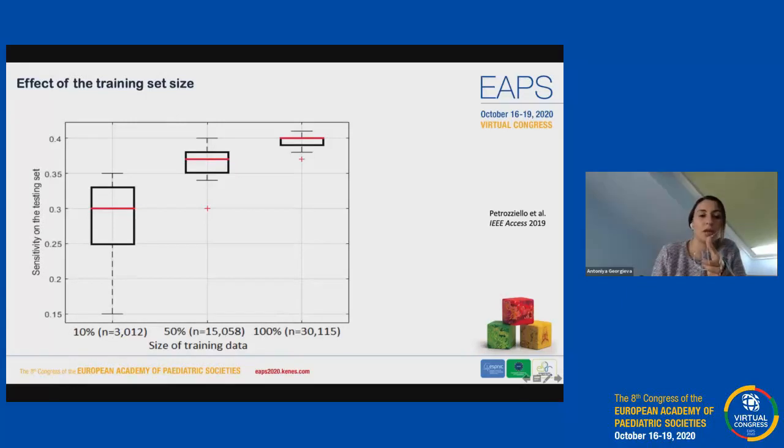And what we're looking at here is the different training data sets, and we're looking at the sensitivity. So this is this yellow bar we just looked at. And the reason why we have a range of values here is because we train multiple models, right? And that's what everyone should be doing. There are variances in the initialization of the weights of the model, and there are other elements. You can think of it as bootstrapping, what people do in statistics as well. This is how you assess whether your model is stable and whether you are likely to be able to generalize on new data sets. So what you can see here is that the variance is very big.